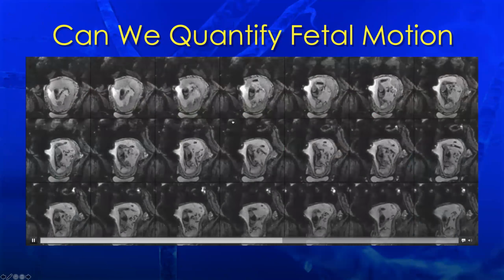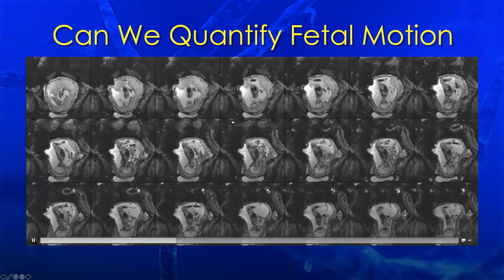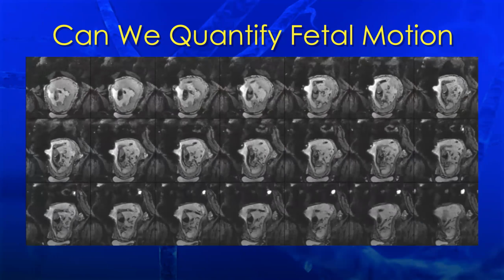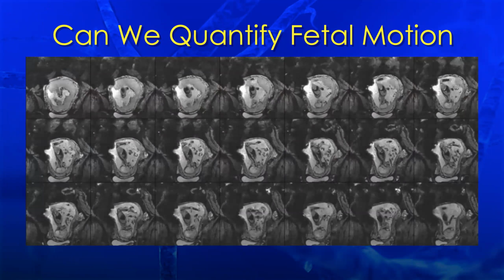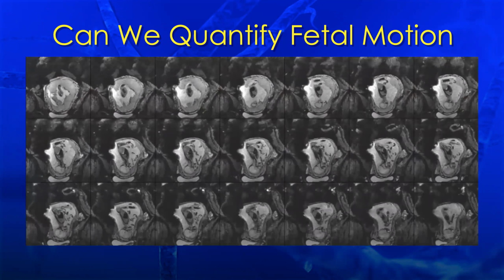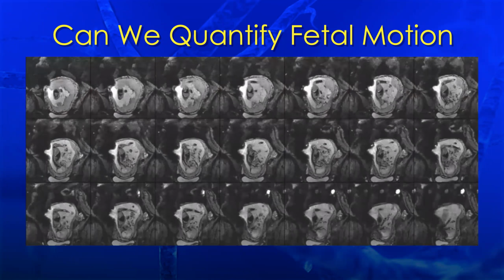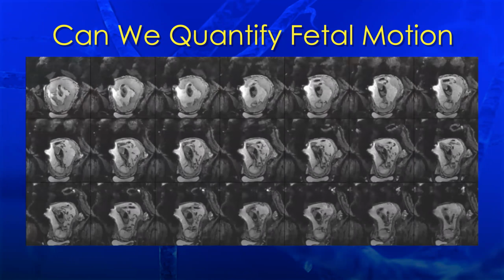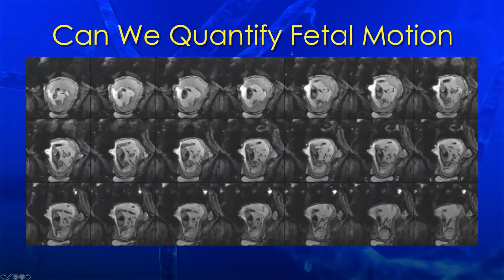Now, fetal motion is something that is very important as well, and it's used clinically, for example, for Chiari malformations, and to assess leg movement. In our center, we do not do fetal interventions, but in sites that do, there are different types of approaches to quantify fetal motion pre and post surgical intervention. So the question is, can we quantify fetal motion and not just do the qualitative metrics that are typically used?